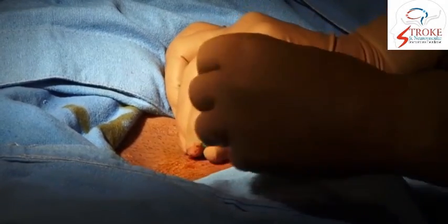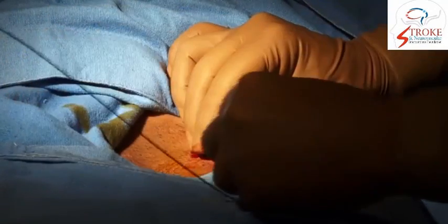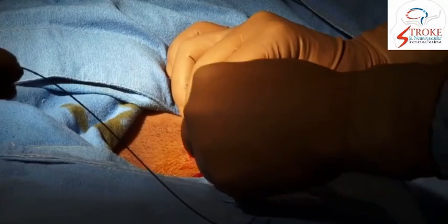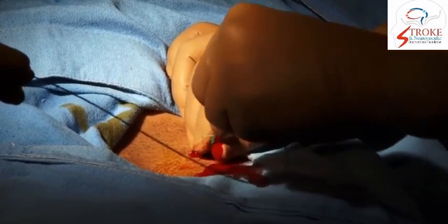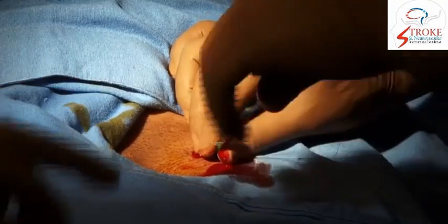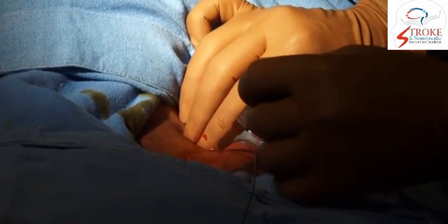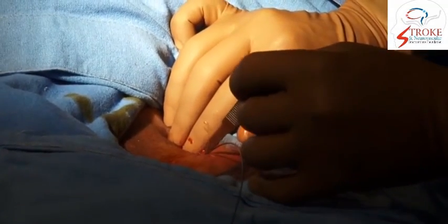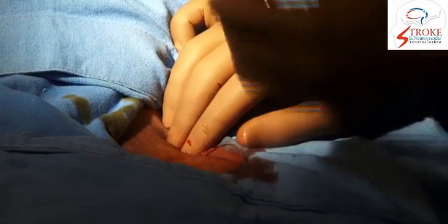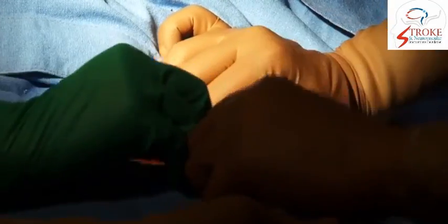We always check for good backflow. And once there is very good backflow, a wire is being placed, in this case a Terumo 035 wire. A small nick is being given in the skin adjacent to the puncture so as to place the sheath, and an 8F short sheath was placed and 5000 units of heparin was given.